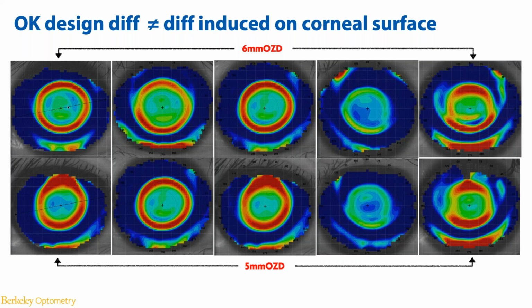So I think that concludes our questions for this evening, unless we have any others that are coming in. It seems like somebody just wants to confirm that the advantage of the 5 millimeter lens design is that it's a faster treatment and more paracentral steepening, although it's difficult to actually measure that magnitude. Is that accurate? Correct, based on this really small study. So I'm hoping to learn better with the actual application of these lenses in a real clinical population.